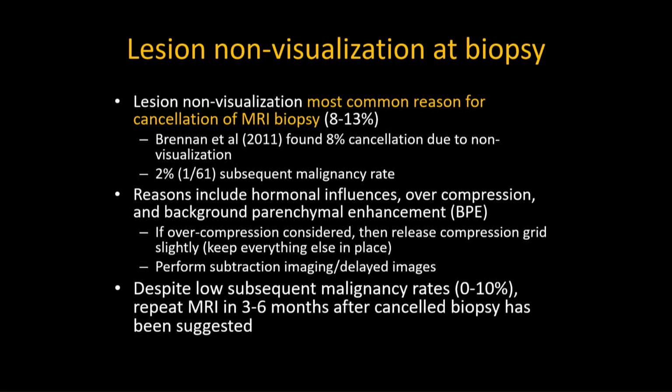Lesion non-visualization at biopsy is the most common reason for cancellation of an MR biopsy, and it ranges from 8 to 13%. A large study done in 2011 of over 900 patients found an 8% cancellation rate due to non-visualization. So what is the subsequent malignancy rate? In that study, it was 1 out of 61, so a 2% malignancy rate. And why do we not see these lesions on the day of biopsy? Well, reasons can include hormonal influences, background parenchymal enhancement, or overcompression.